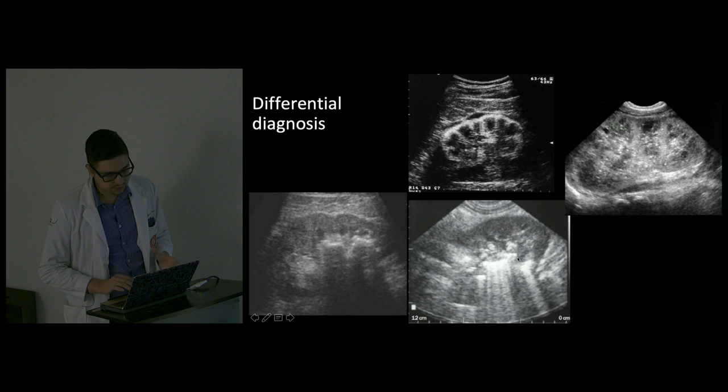Another differential diagnosis, something that can cause similar findings on ultrasound, is emphysematous pyelonephritis, but the difference is that we have a dirty shadowing, not the acoustic shadowing that you find in nephrocalcinosis. Okay, that's everything.